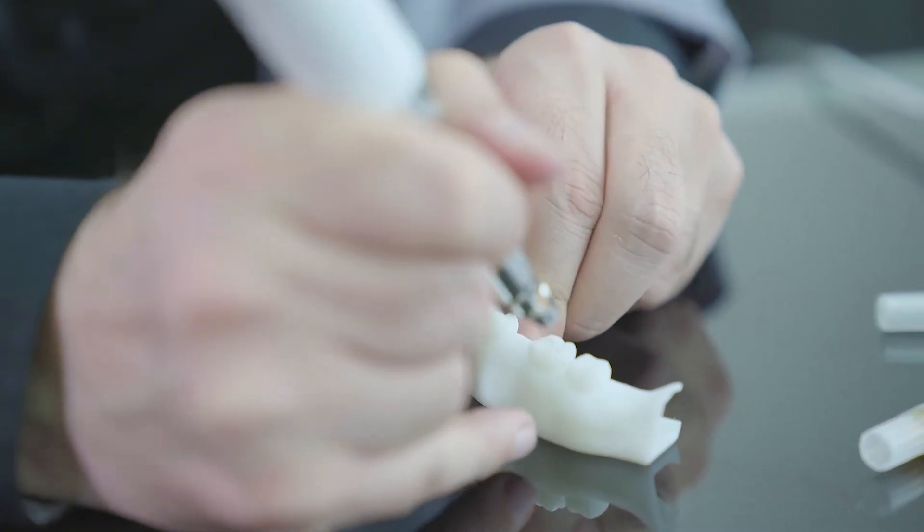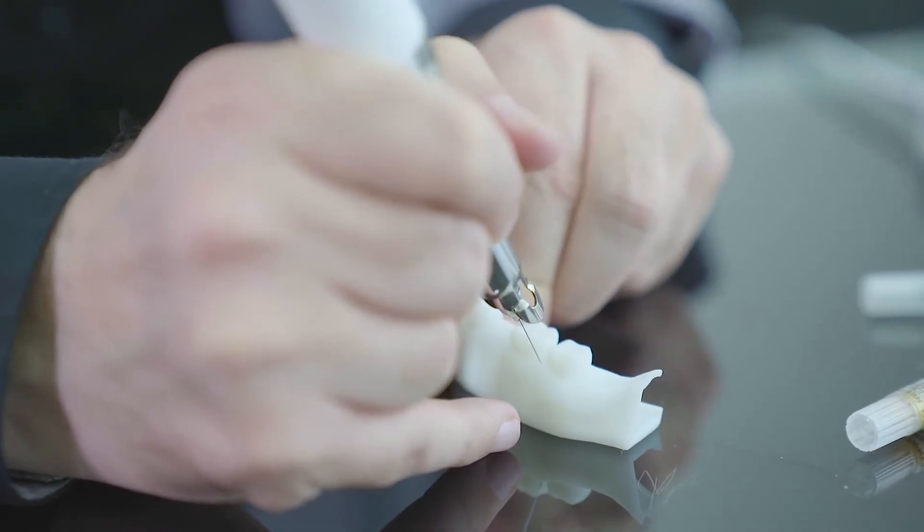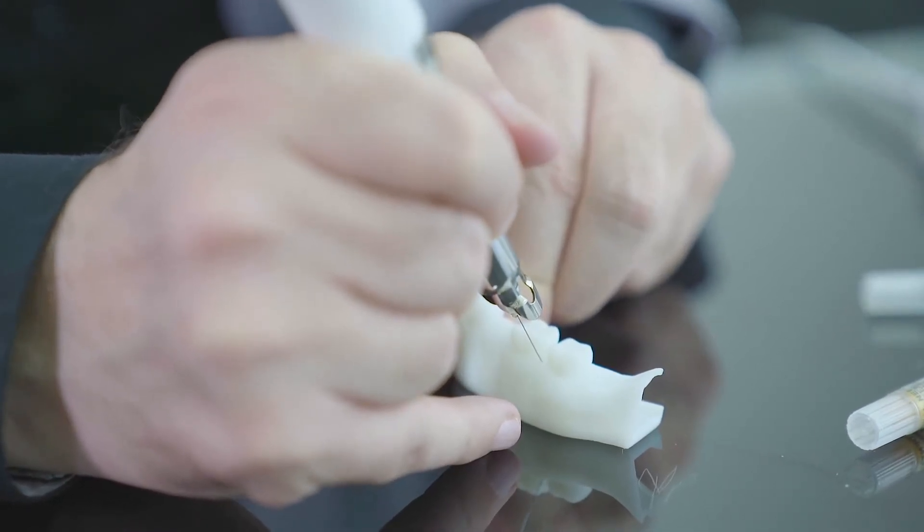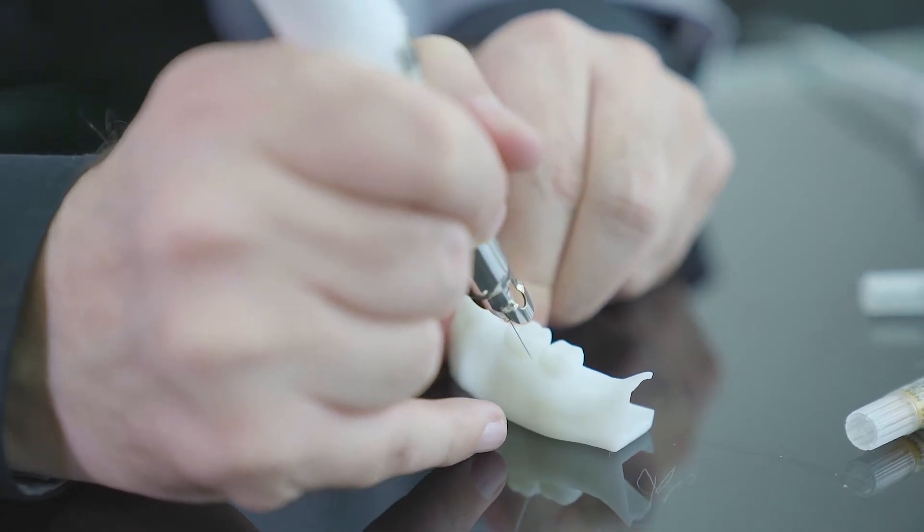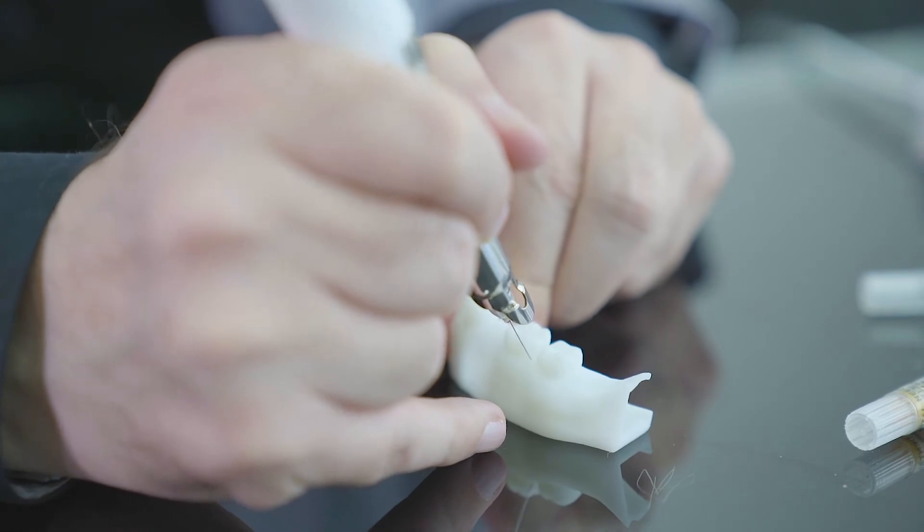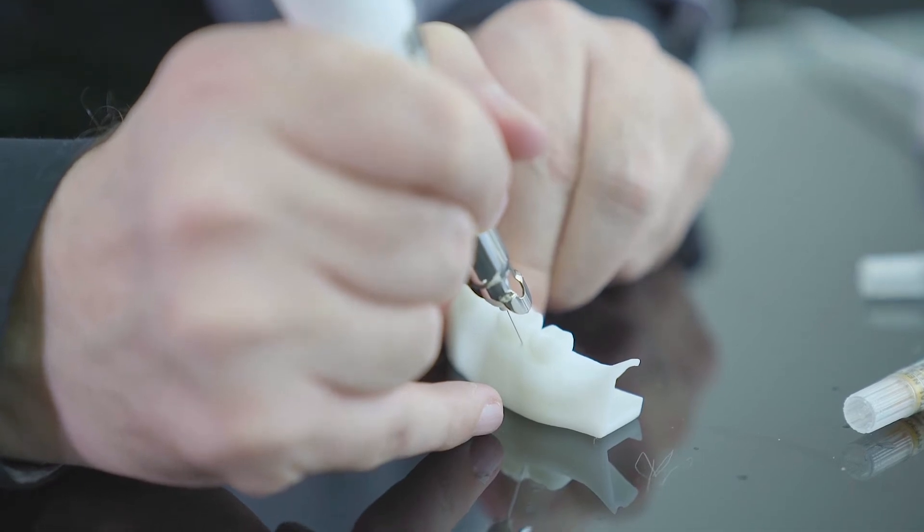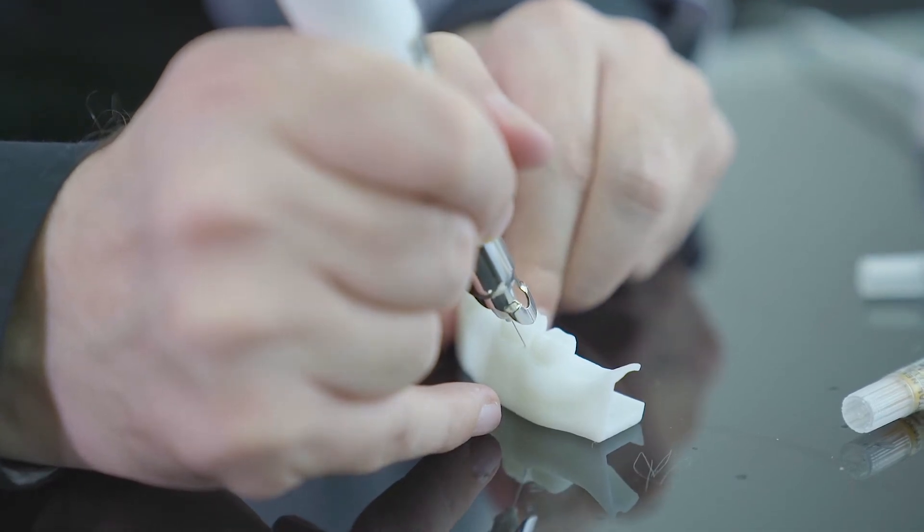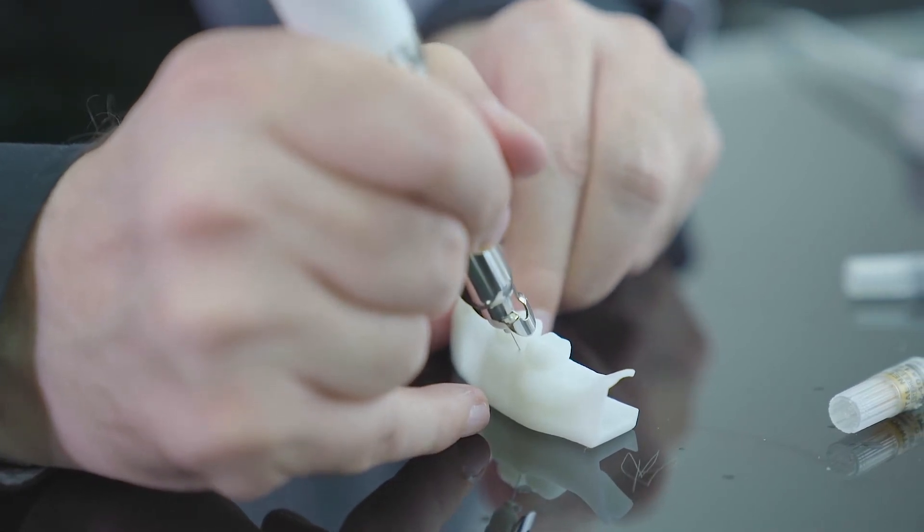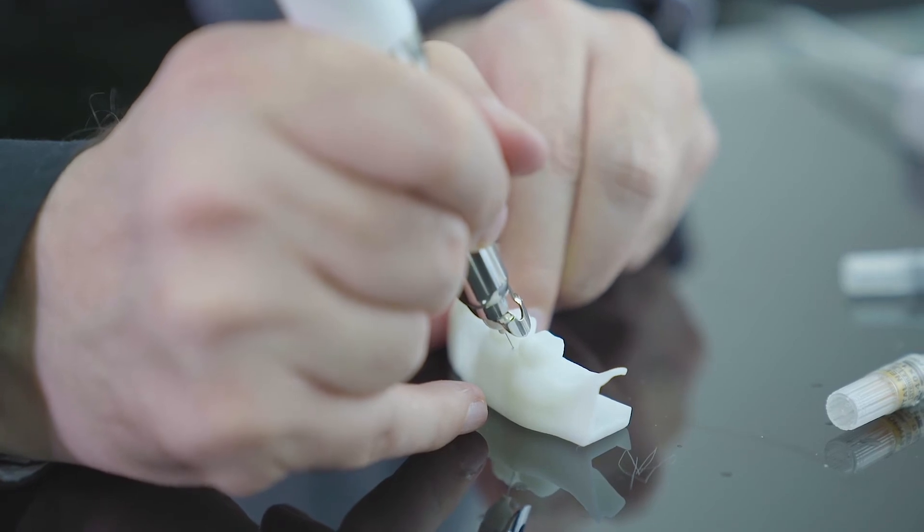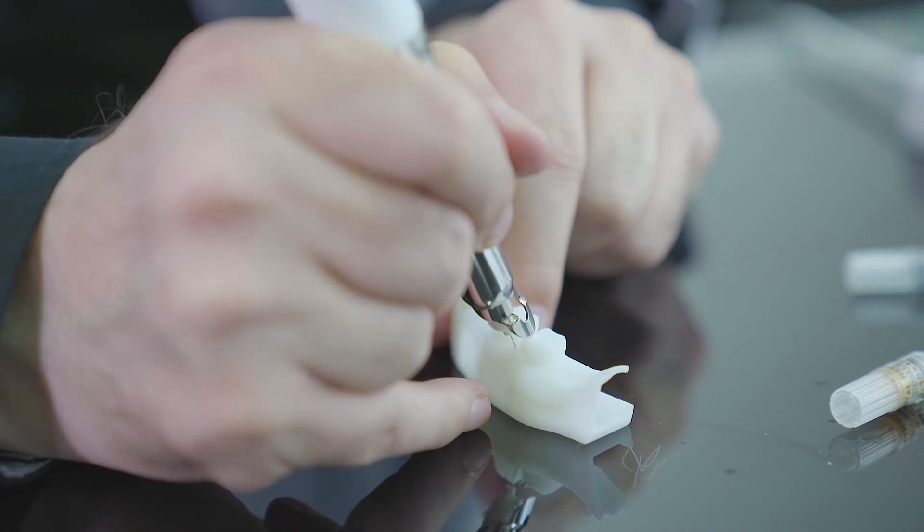Going to the position of intraosseous. I will place my needle over the bone, then I will press the orange pad of the pedal, which is the rotation pad. Now I'm going in. It's a pulse drill. You will feel like this. It's dropping inside the spongy bone, the cancellous bone, which is the enough level of drilling, of insertion.